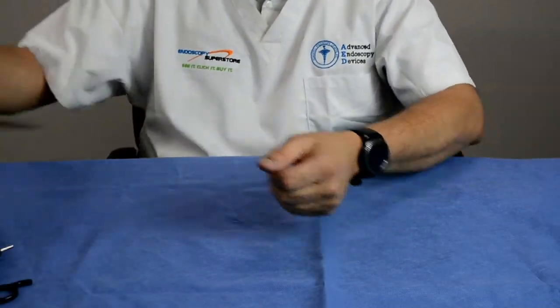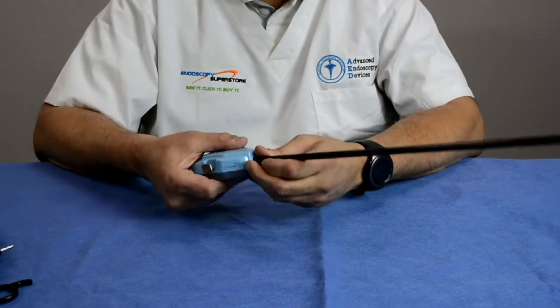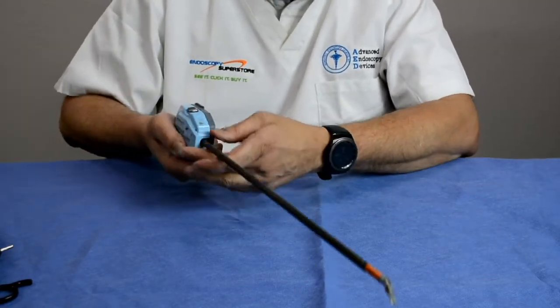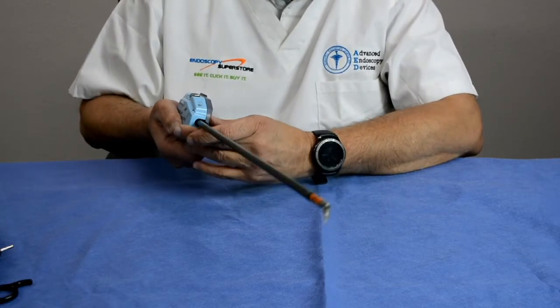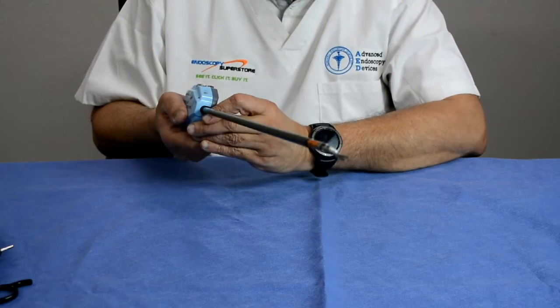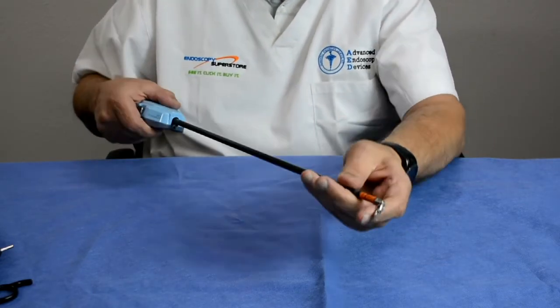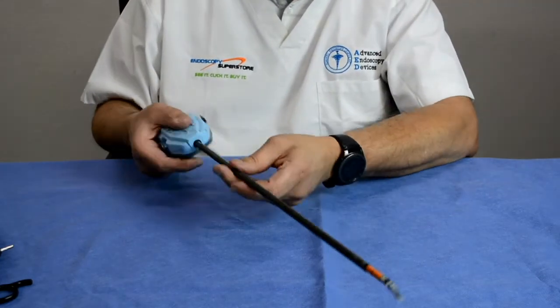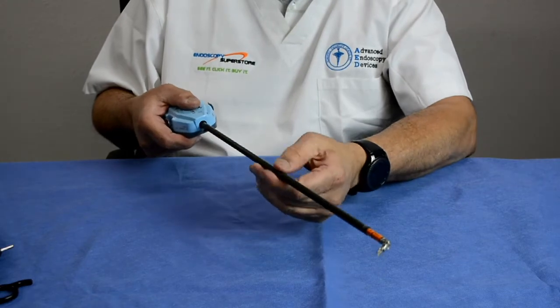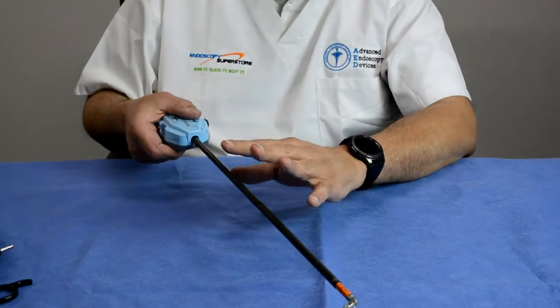Other companies have also made articulating instruments — including a robotic company with an articulating tip where the tips move and rotate and the jaws open and close in any direction. This connects to a robotic arm placed inside the patient. The drawback is that these are expensive and must be replaced after a certain number of procedures.